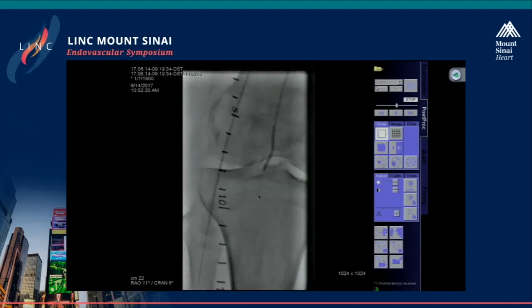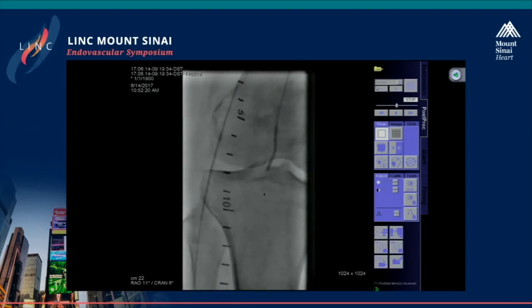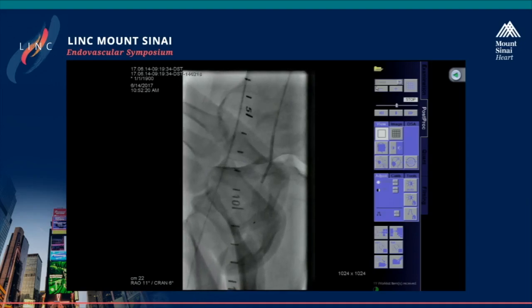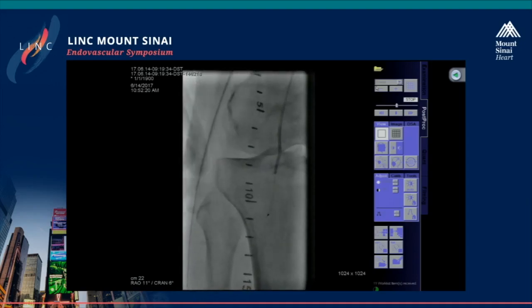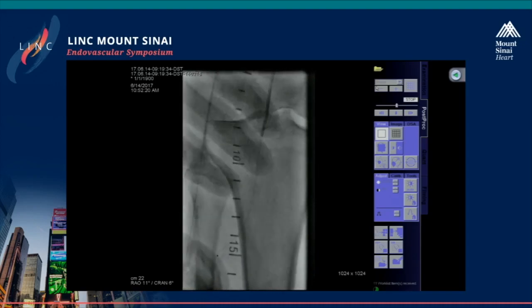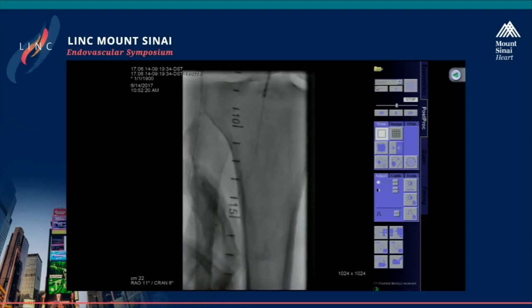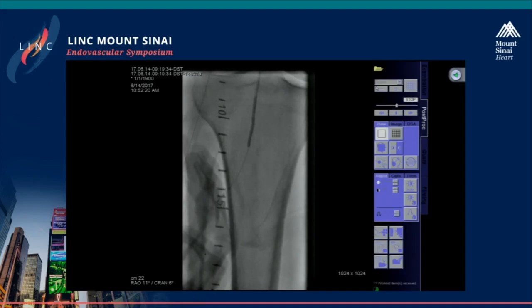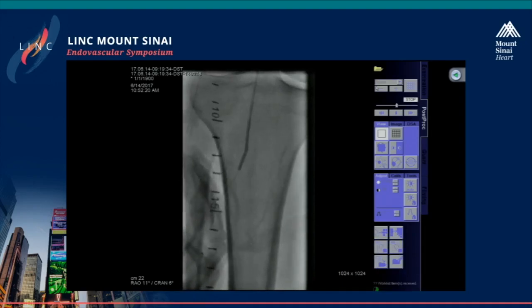I don't know whether you use any different catheters, but that's what we use. But I think the real challenge, more than crossing here, is how are we going to treat this? So I'm going to let you work in peace here and ask somebody here. Miguel, I would almost think of a different way to do this, maybe going antegrade and ballooning that SFA lesion first so that you could increase the flow, and then take an 018 catheter down and have a low threshold if you couldn't cross antegrade from going tibial, because that beak or hibernating area that he talked about looks pretty good for retrograde. What do you think about access strategies, briefly, while he's working?